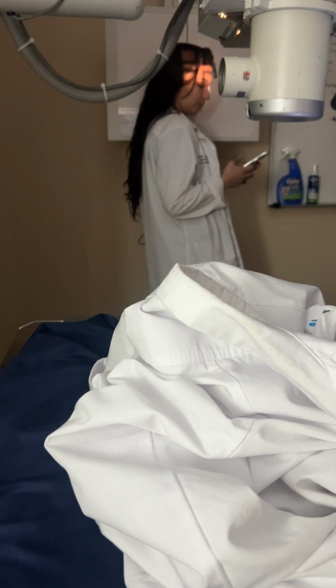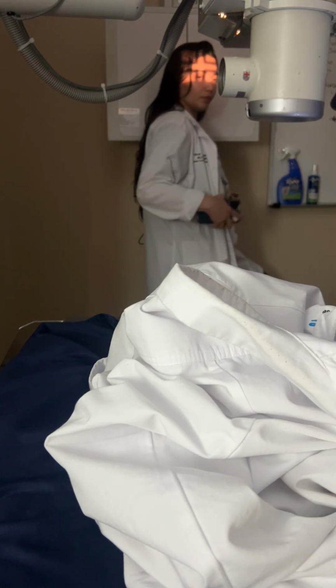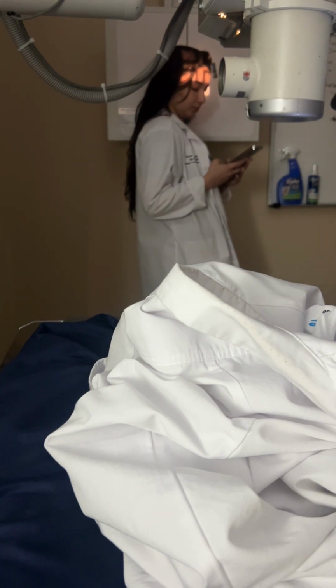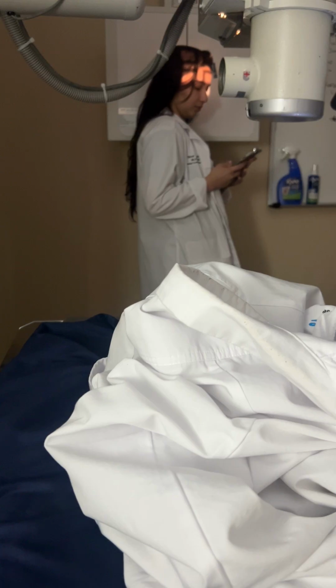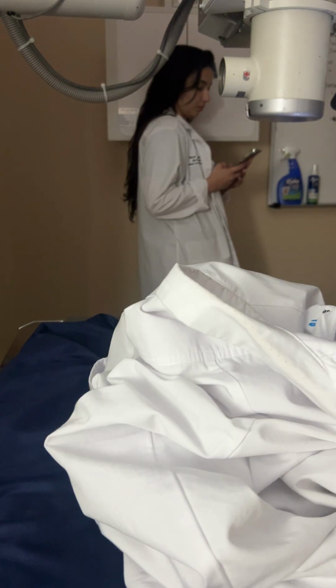So what are the views for the mandible? Axiolateral oblique, and AP or PA. Is there another page? Why did he say 3 positions? I don't know, because I only count 2. Okay. We're only going to do 2. We're not going to make it hard. Yes. Just the 2 positions. That's all I see.